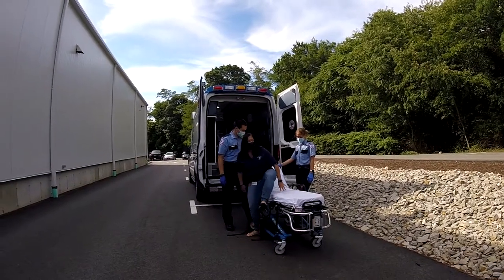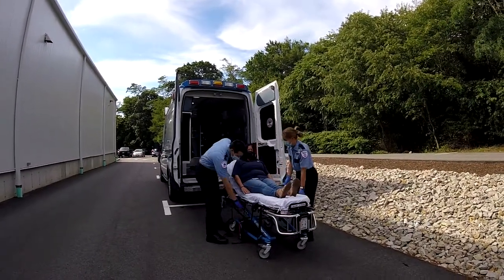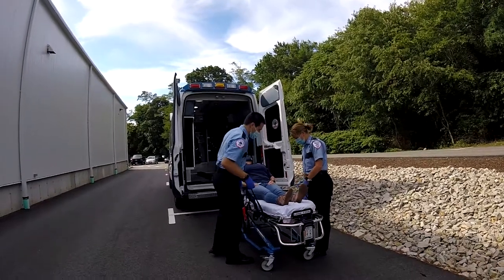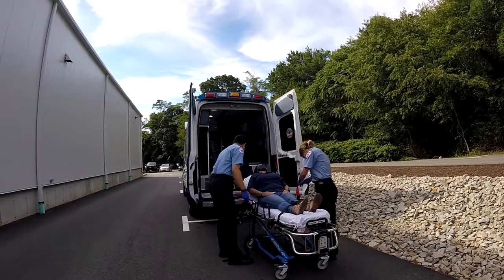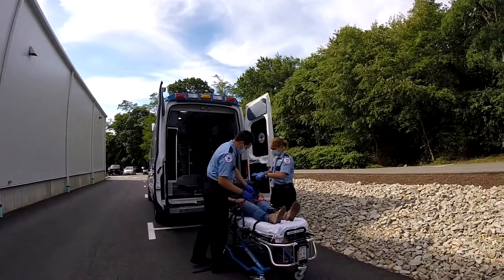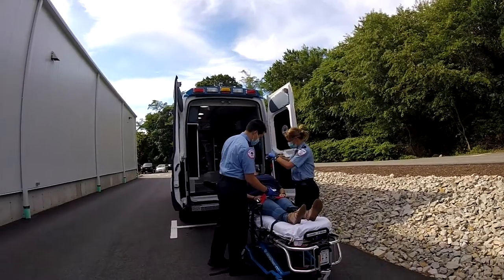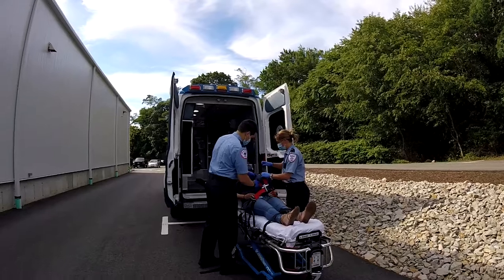When securing a patient to the stretcher, make sure both side rails are in the up position and secured. All seat belts must be fastened in proper positioning, as shown here. Please remember to use blankets to keep patients warm and comfortable, especially in the colder weather.